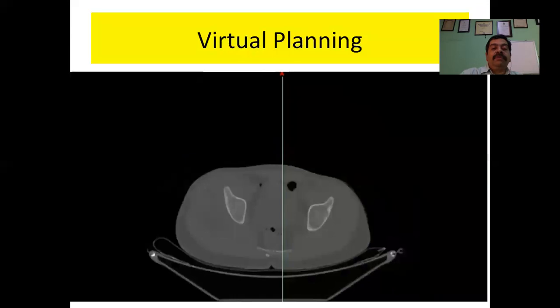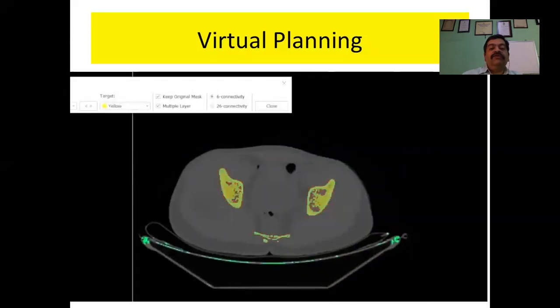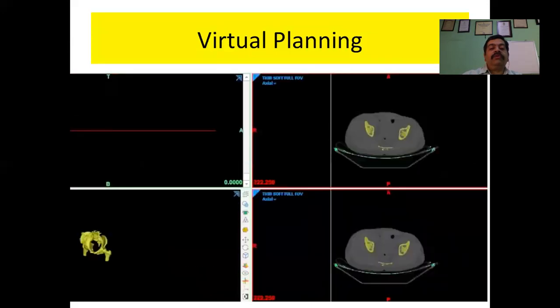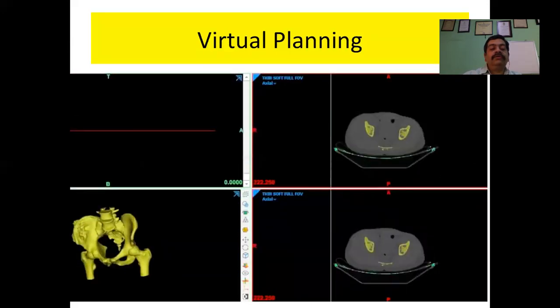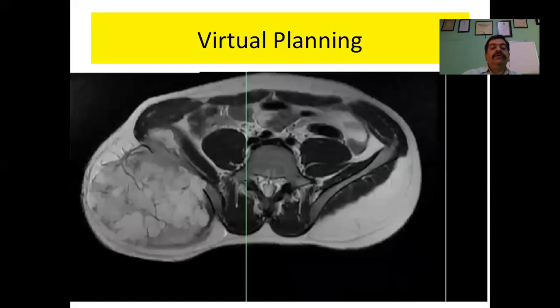So here's an example of how you go about the virtual planning. It starts with a CT scan in which you try to extract whatever bone you're interested in. Here is a patient with a chondrosarcoma of the iliac bone. And here is an MRI now. We took the CT and now we're taking the MRI images.